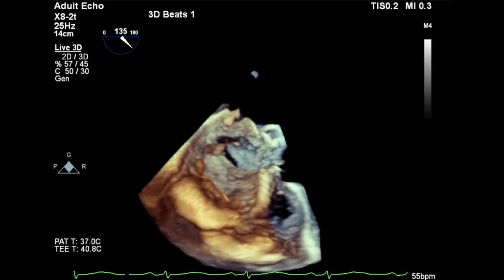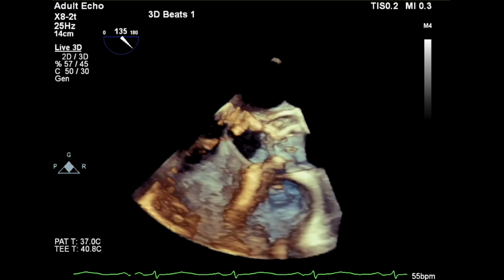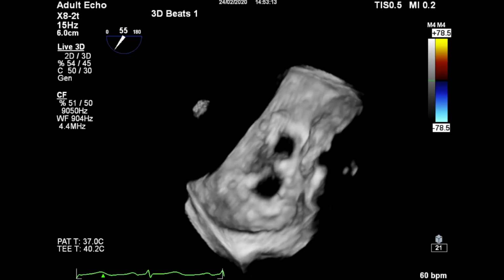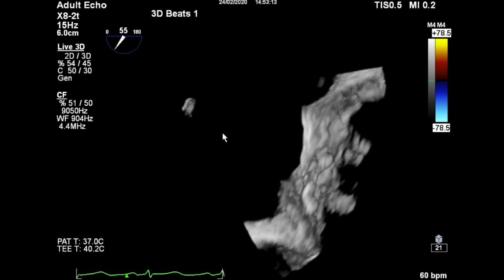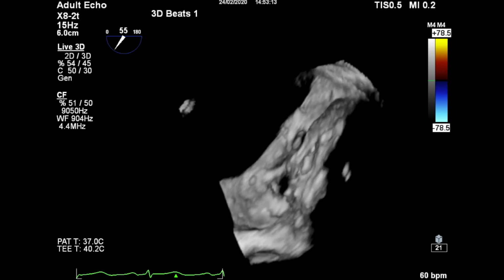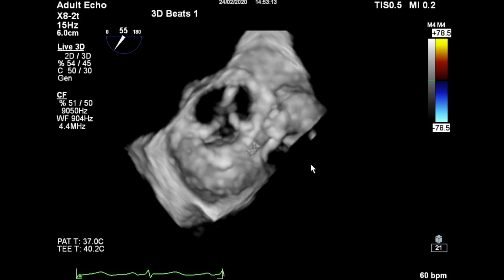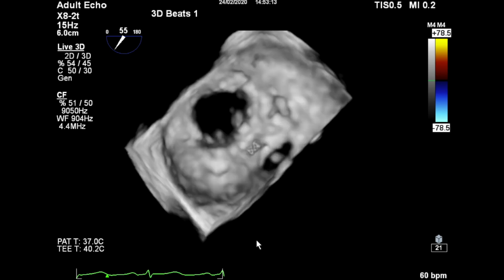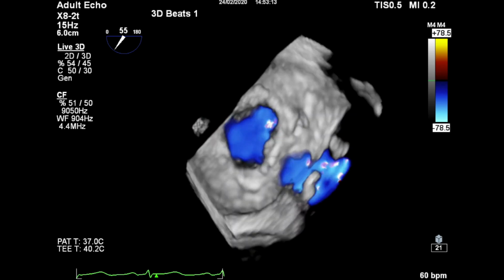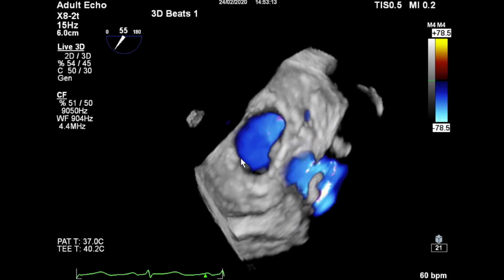So I'm going to lift the picture up. It carries on behind this region, and that's that region here in the lateral wall that's thinned and forming that sort of aneurysmal tissue. So there's the mitral prosthesis. Behind here is where the aorta would be, and the AVR is down here. So just to get your landmark. This is looking into the left atrium, and you can see this is the defect that we were looking at. But what's interesting is if we put the color back on, not only are we seeing this defect, here you can see it sideways. I hope you can appreciate LVOT through the hole into the left atrium.